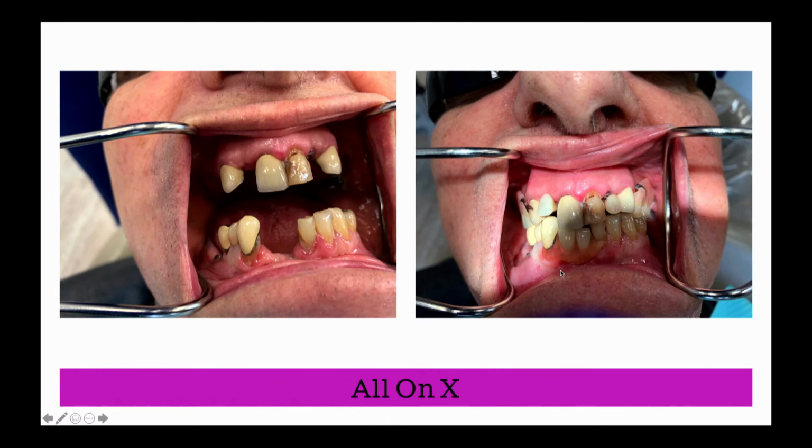He has a partial down here, as you can see. But he had a lot of trouble with an upper partial and just never wore it. So those are the kind of things I hear. I say, man, how can I treat this case without putting him into a denture, because he's going to have a healing time that he's going to absolutely hate. And I don't believe in taking a lot of vertical bone away to get implants stable so I can load them the same way. It's just not my approach to dentistry.